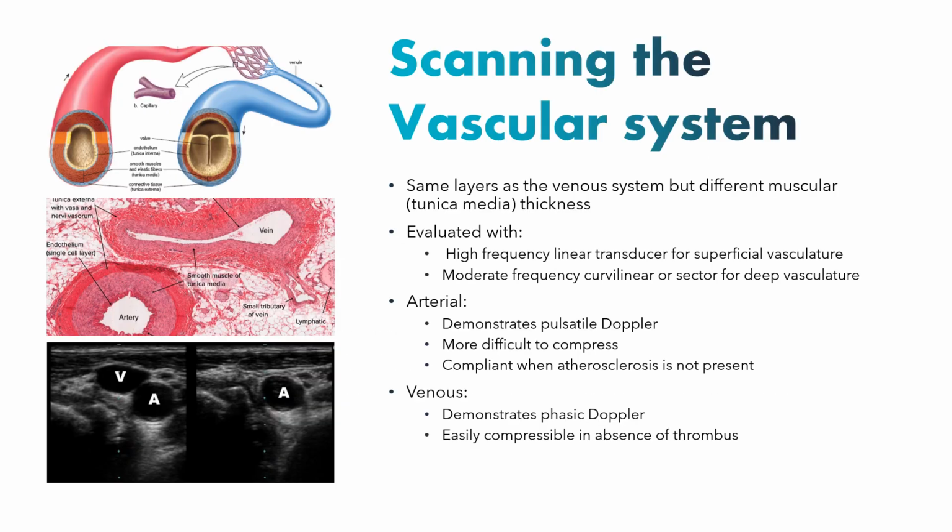So we know that you are all very busy providers and you may not have the time to sit down and do a full scan that would be done in an imaging department. So when we're focusing on these ultrasound techniques, what we really want to do is teach you the basics of good standard practices. And then when we get into the individual exams in the following lectures, we'll talk more about exactly the locations of where you're going to want to implement these practices in order to get the most bang for your time.